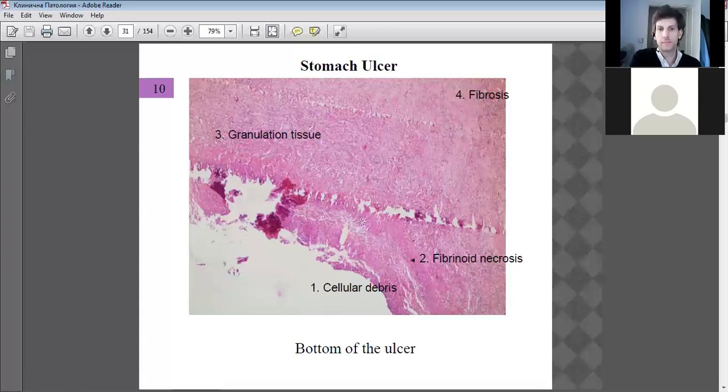Why is it dark red like on the left-ish part? Dark red, okay. This is a consequence of bleeding. This is a consequence of capillary bleeding, and also a mixture of cellular debris as well. So there's some clots there, clot formation. That's the main reason.